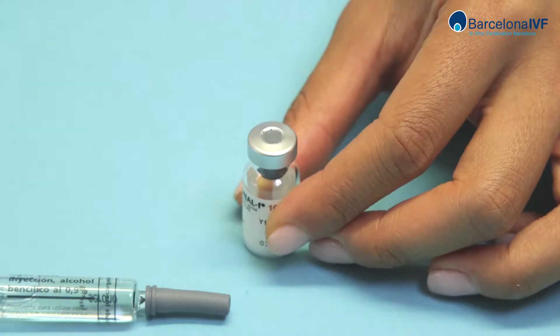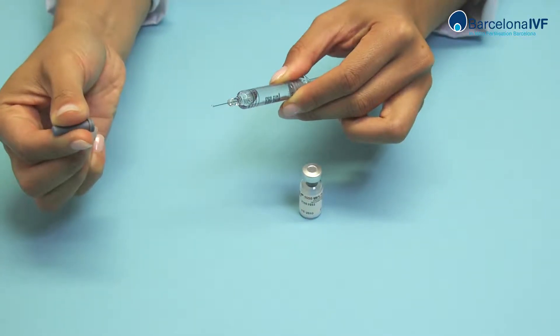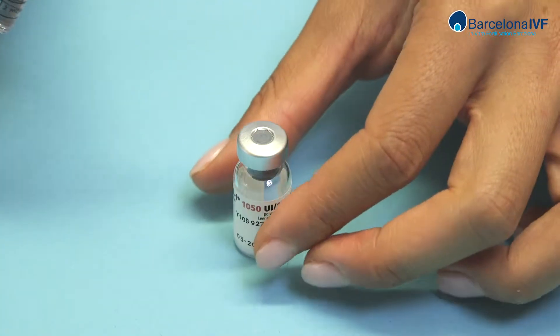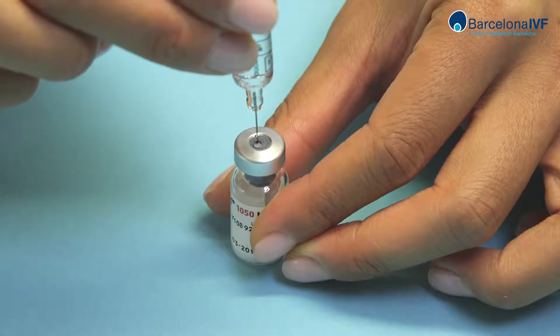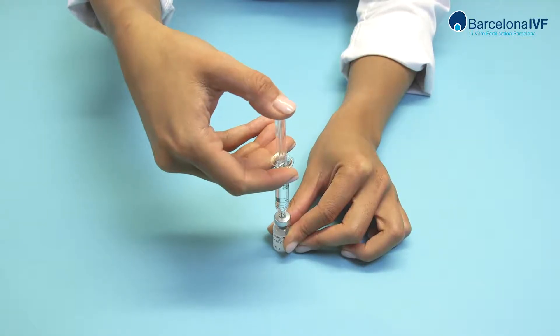Remove the cap from the powder vial and the protector from the syringe. Place the vial of powder on the table, hold it with one hand, and introduce the syringe in a vertical position into the vial with the other hand.